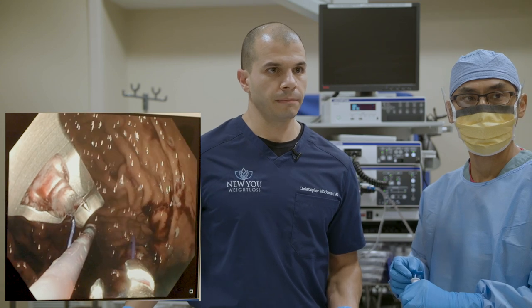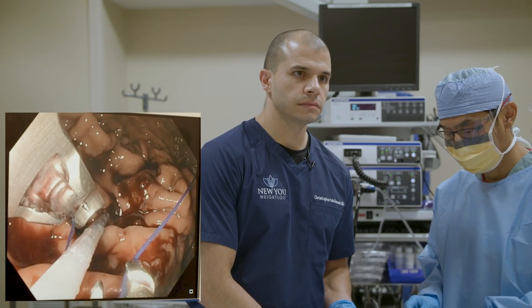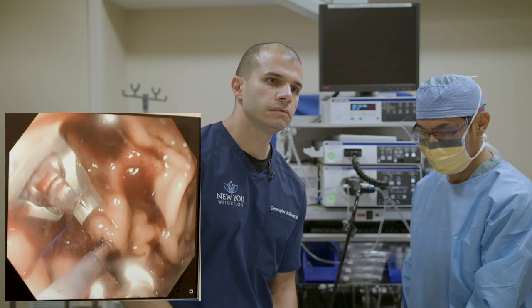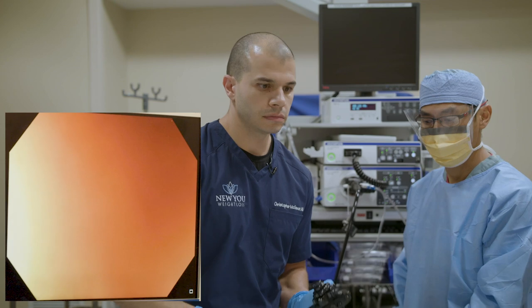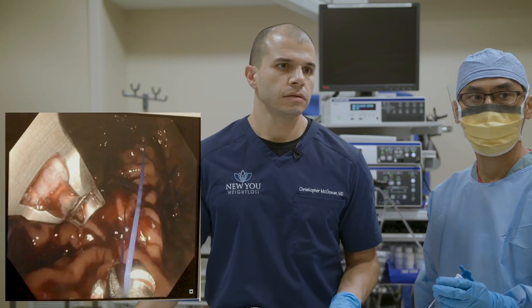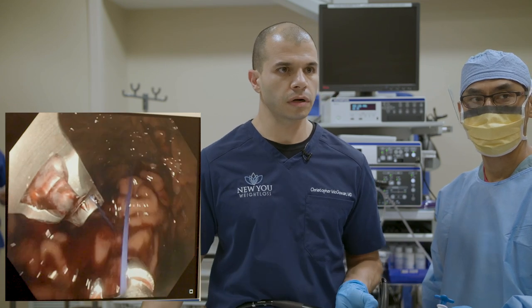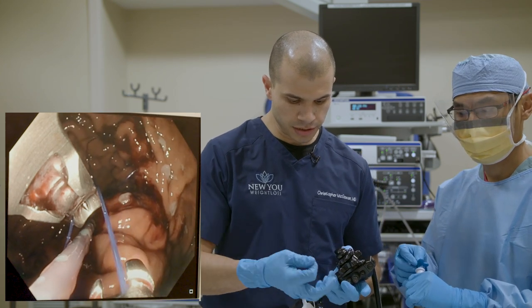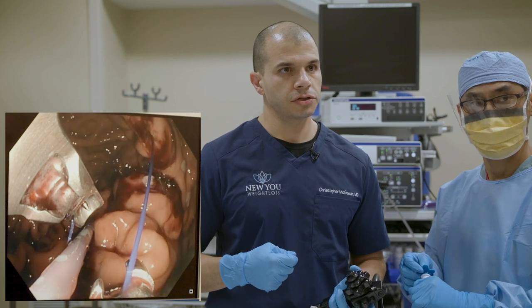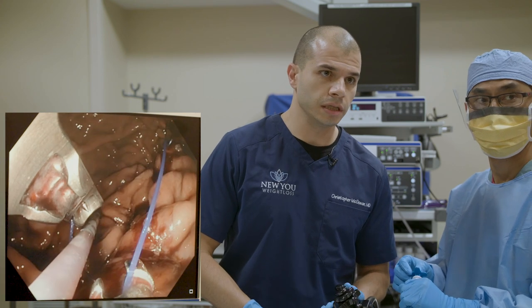We've worked our way down the stomach and are coming back up again into a U-shape. Question from Ashley: will I develop saggy skin from weight loss with ESG? You don't see it very often — the weight loss is gradual, over a year or more, typically losing a pound to two a week at most. As long as you're exercising — we recommend strength training or resistance exercise at least twice a week — we're usually able to maintain tone. But certainly if you're losing a lot of weight, there's that potential, though we don't seem to see it very often.